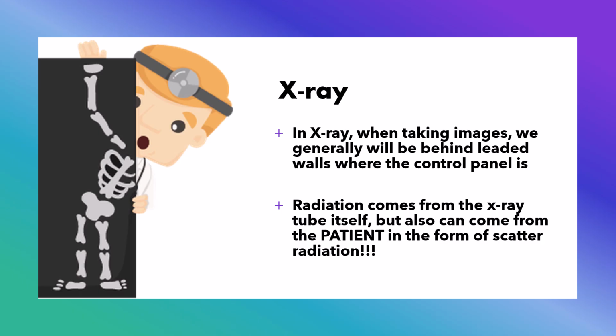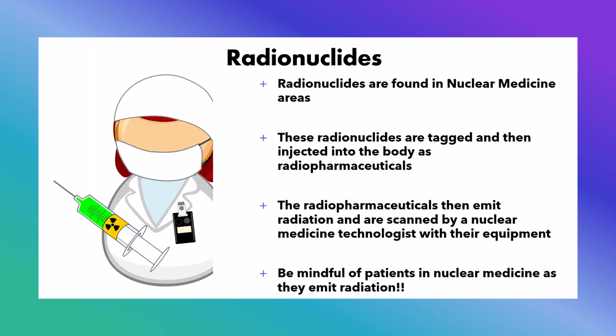Keep in mind, X-rays are like light. When you have the X-ray machine on, it's producing X-rays. When you have the light on, it's producing light. If you don't have the X-ray machine on, it is not producing radiation, just like when you don't have the light on, it's not producing light. So I just said radionuclides a second ago.